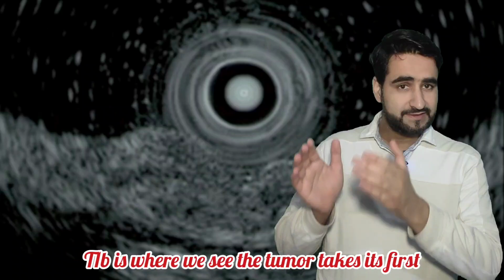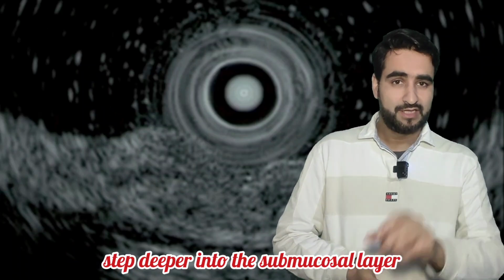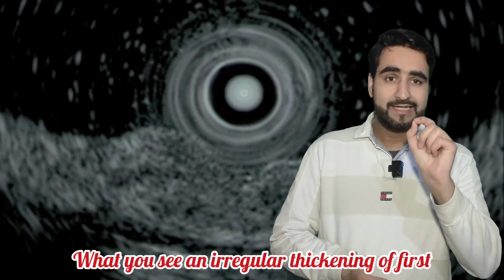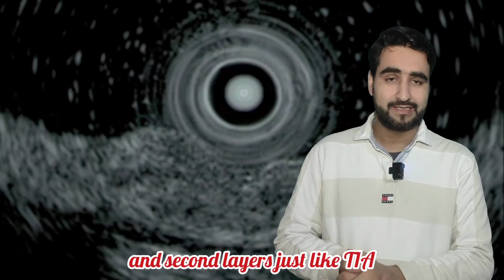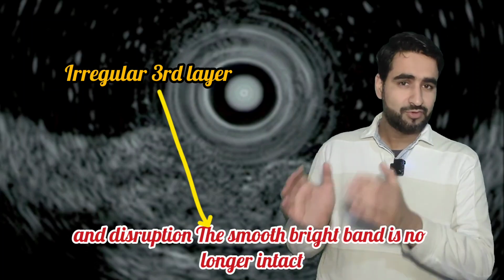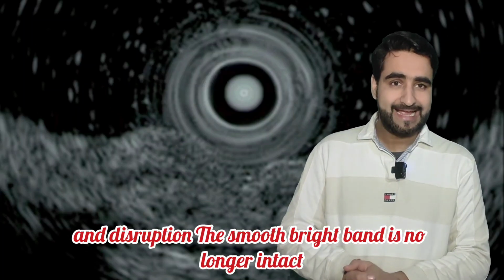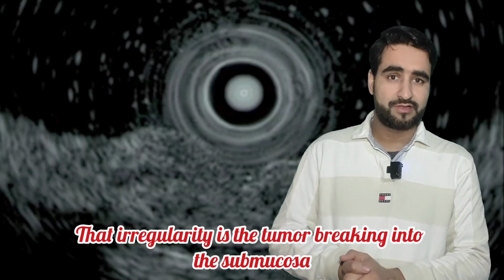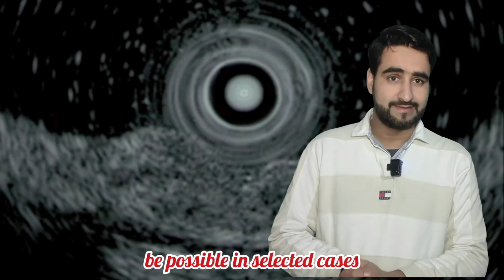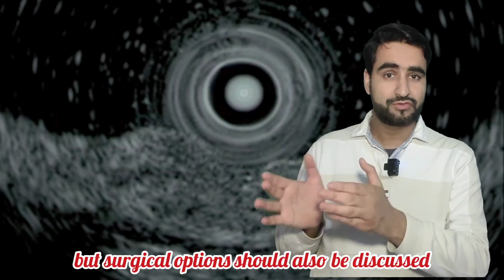T1B is where the tumor takes its first step deeper into the submucosal layer. The endoscopic ultrasound pattern shifts noticeably. What you see is an irregular thickening of the first and second layers, just like T1A. The hyperechoic third layer shows irregularity and disruption. The smooth bright band is no longer intact. That irregularity is the tumor breaking into the submucosa. Endoscopic submucosal dissection may still be possible in selected cases, but surgical options should also be discussed.